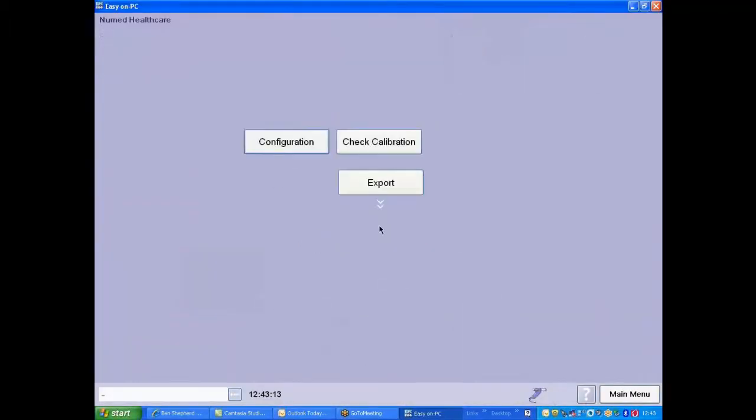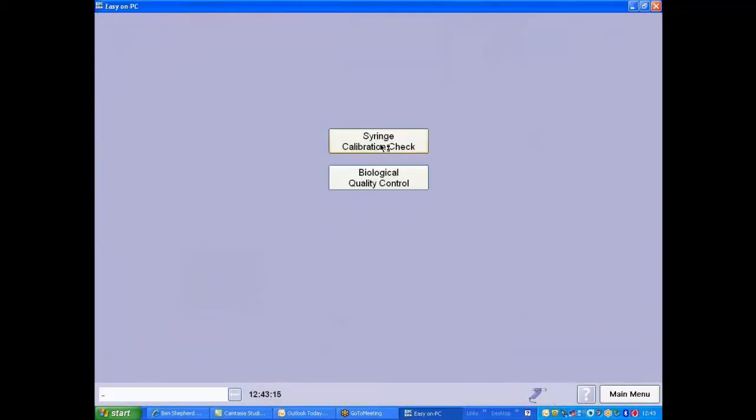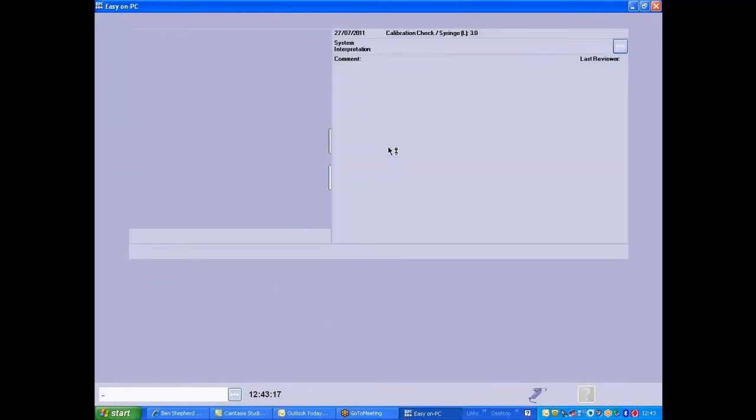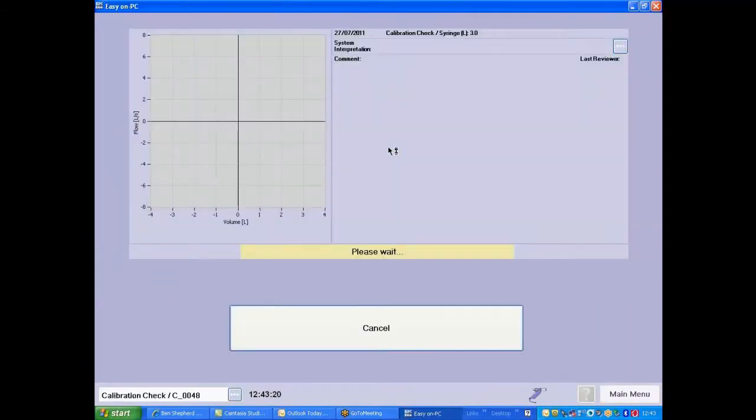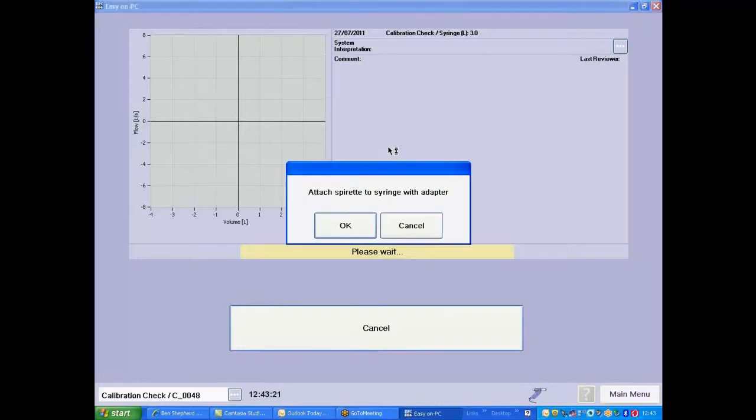Click on Utilities. Check Calibration. Syringe calibration check is what we're performing.